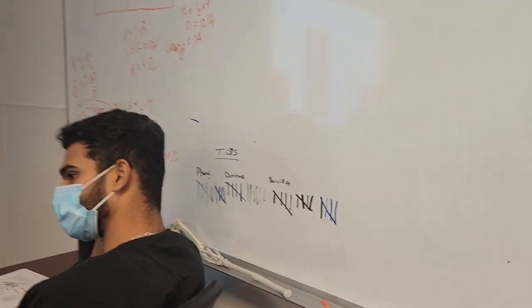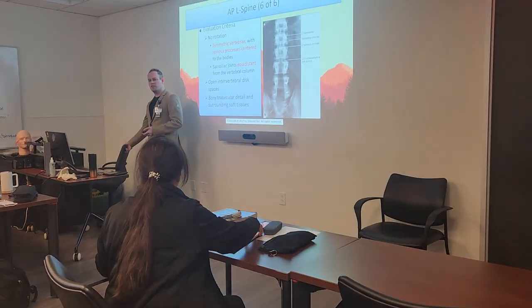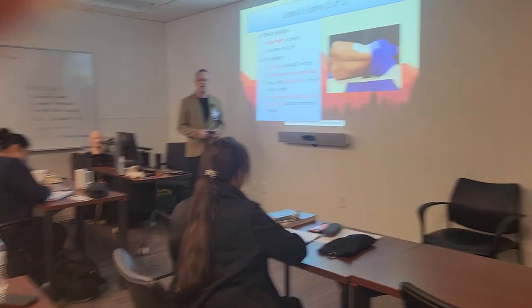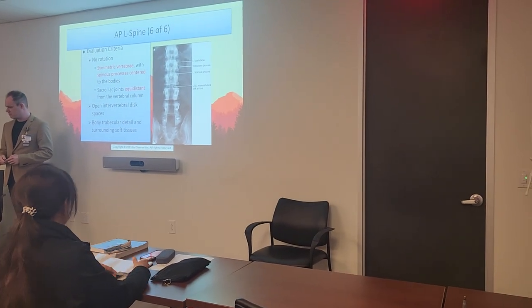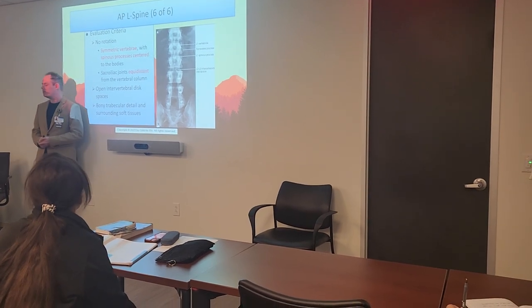All right. Okay, guys, so we left off talking about the AP L-spine. And naturally, what's going to come next? The good old lateral L-spine. We didn't do that. I think you stopped it, but we didn't have that. Yeah. Oh, okay. Well, we can hit that again. Just talking about evaluation criteria on the AP L-spine.